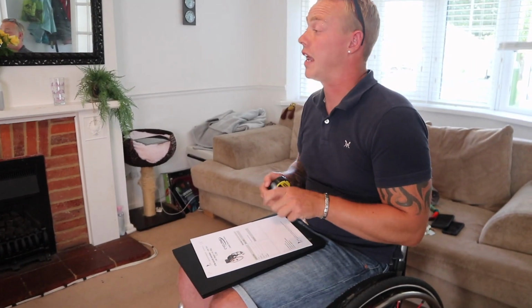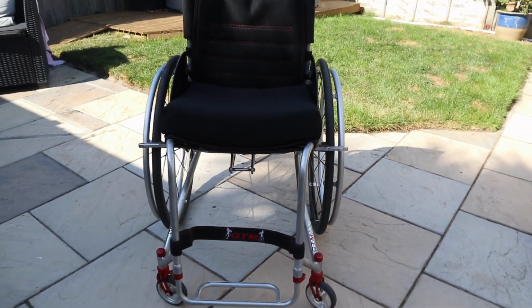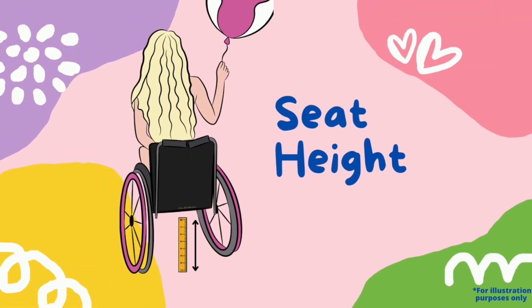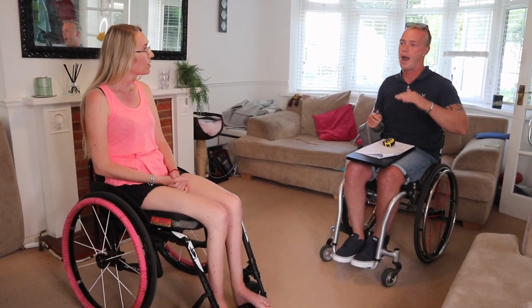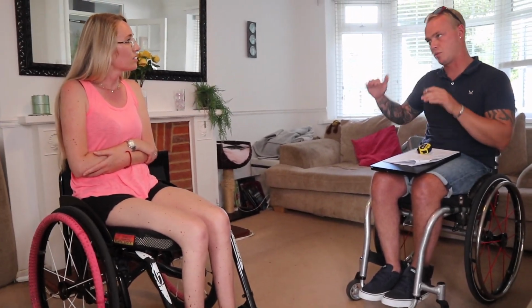Yes, the Jaguar is a fixed chair, so every measurement that's taken, there's no adjustment in it once it's made. The only adjustment there will be is slightly in the footrest. So we start off obviously with the seat height. So that's the overall height of the chair, so that's how high you really want to be sat in the chair. With your leg length, obviously we wouldn't want to go too low because then we won't be able to put too much bucket into it.